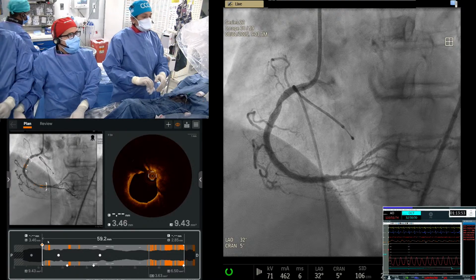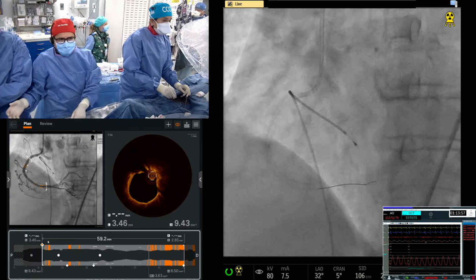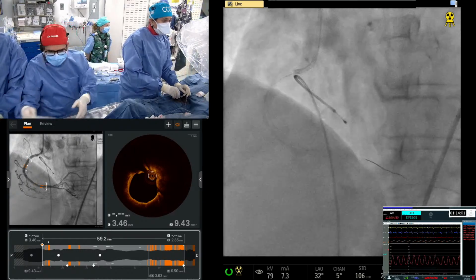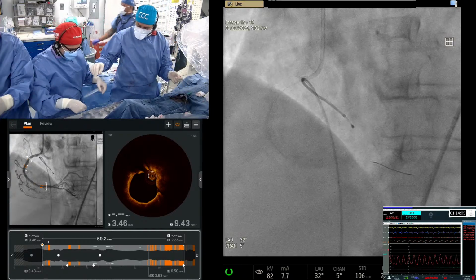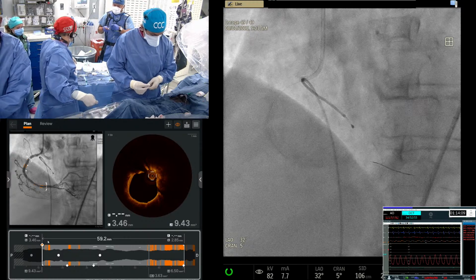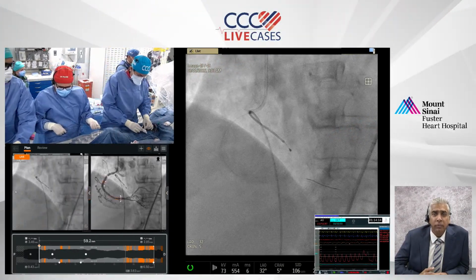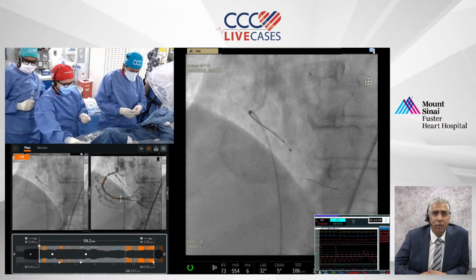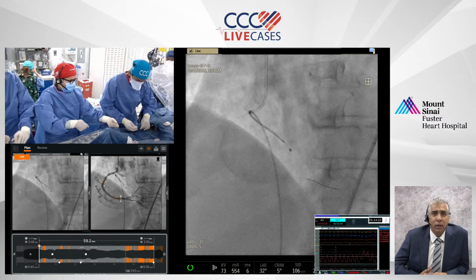Okay, yeah, no harm. And then get us a post, and then we will do one final OCT. Then we have a couple more slides. That's it. Any more questions so far? Because I think algorithm-wise we'll go over it again. Yes, but this has been wonderful. It really showed the decision tree at all levels and the thought process, and this is the kind of case that would certainly be encountered on a fairly regular basis.